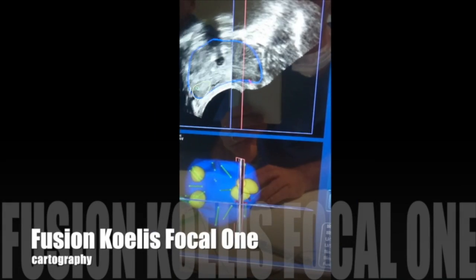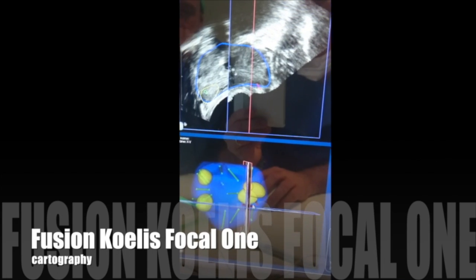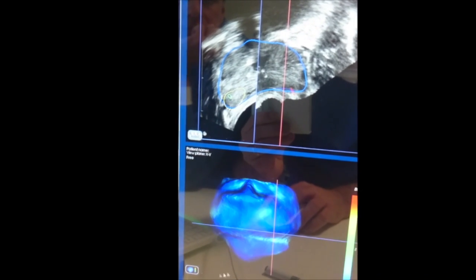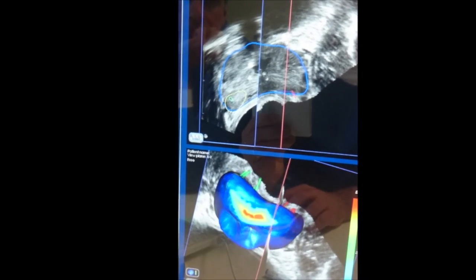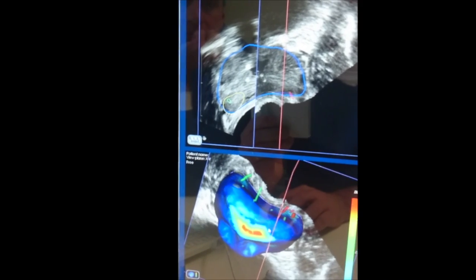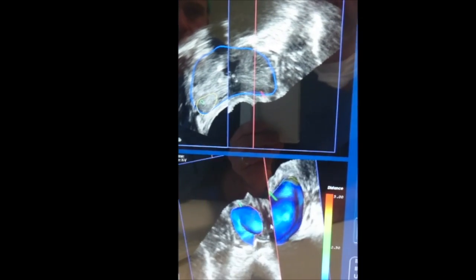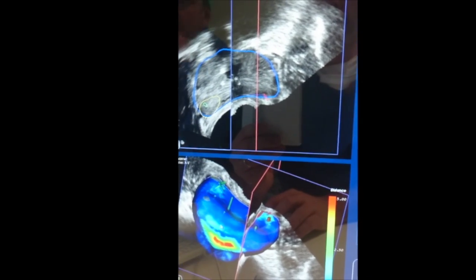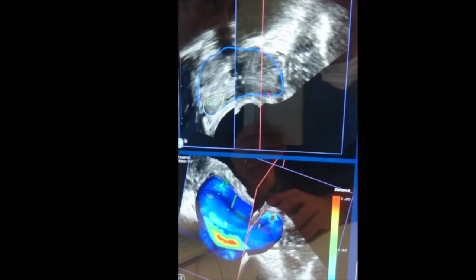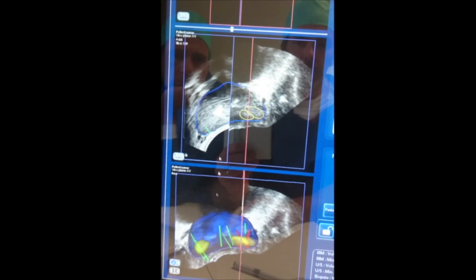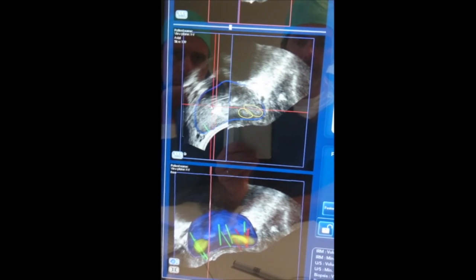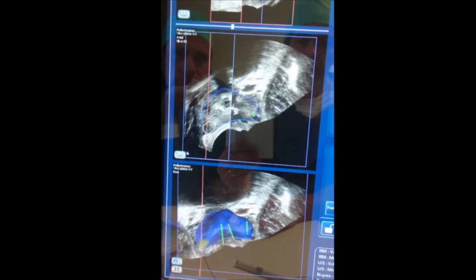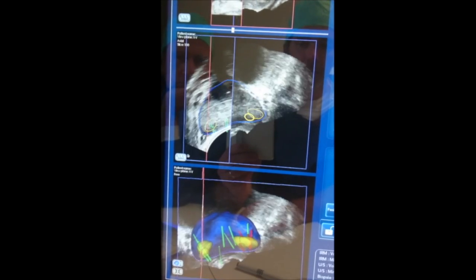You can realize the fusion with the Focal One 3D echographic mapping, the 3D MRI mapping, or the 3D Koelis mapping. The color of the prostate reflects the importance of the distortion during the fusion: in blue when there is a good match, or in yellow if there is an important distortion.